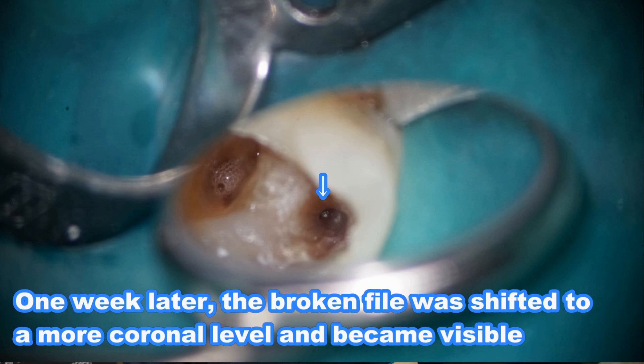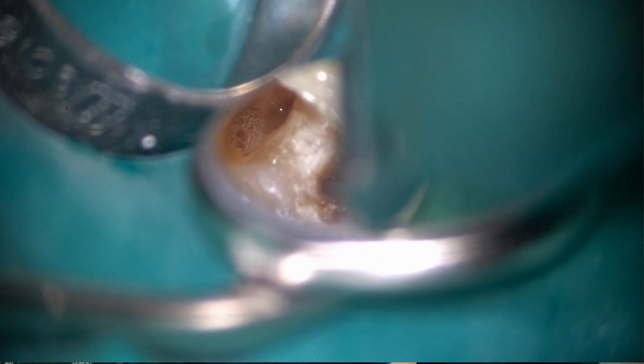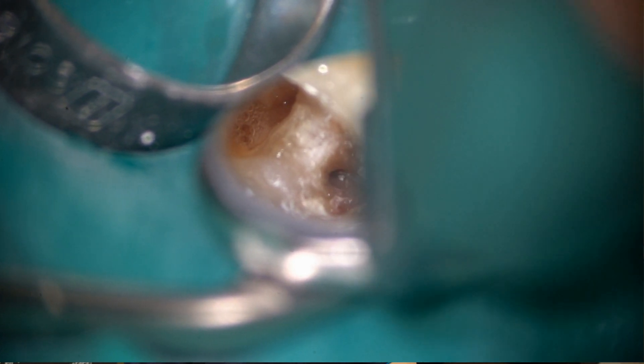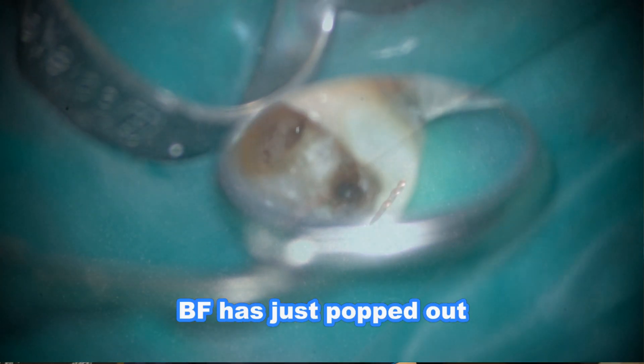Now this case became very easy. I can see the broken instrument, so I need to sneak into the space on the inner wall. Then all I have to do is activate the ultrasonic — now it's coming out in a coronal direction and has just popped out.